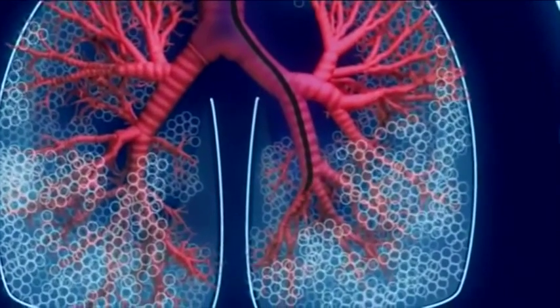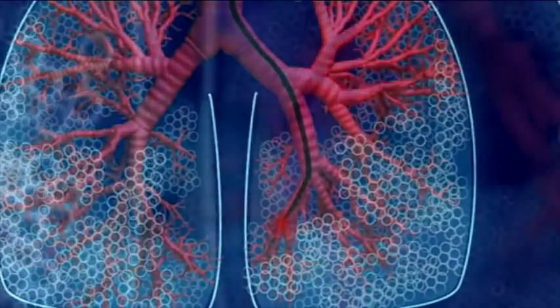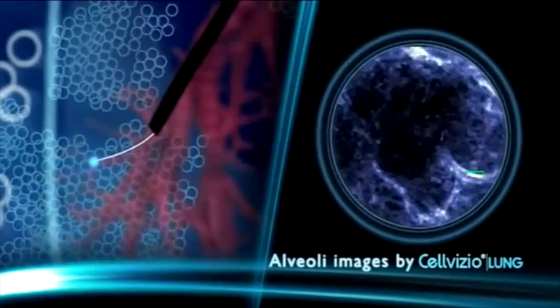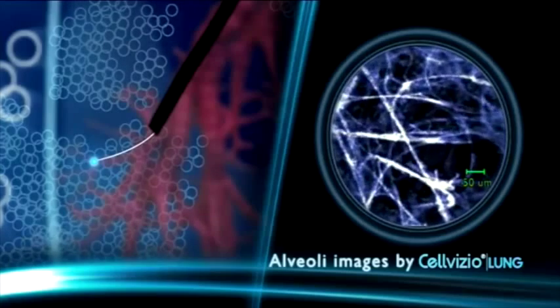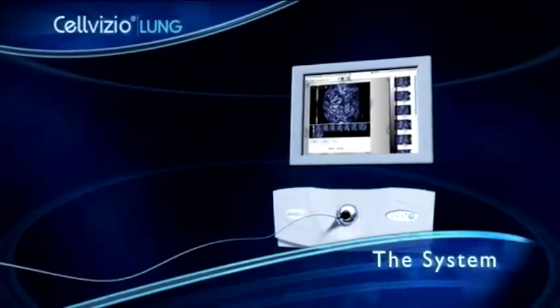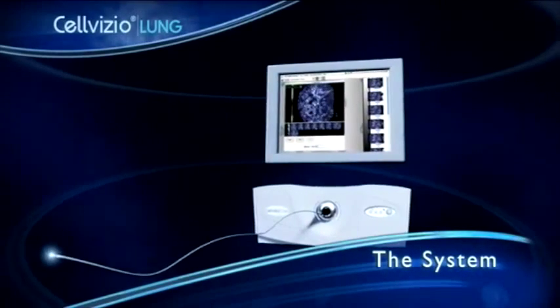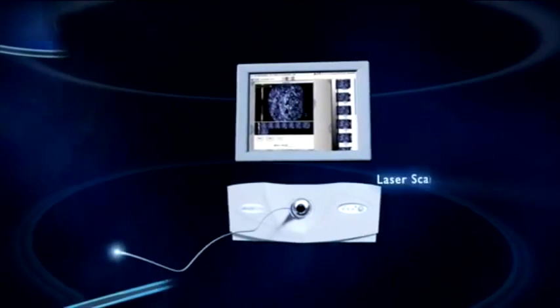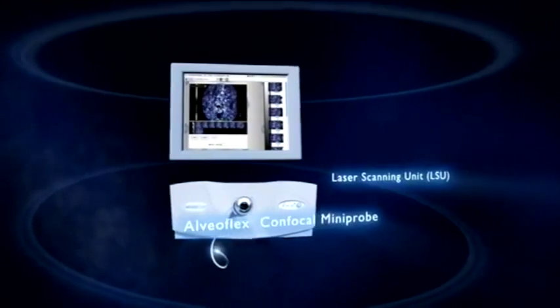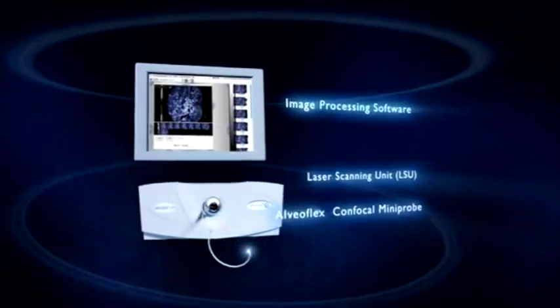Cellvizio Lung begins where bronchoscopes stop. It can reach the alveoli and visualize their dynamic process at a microscopic level. Specifically designed for microscopic observation in the lung, the system comprises a laser scanning unit, the AlveoFlex confocal mini probe, and a proprietary image processing software.